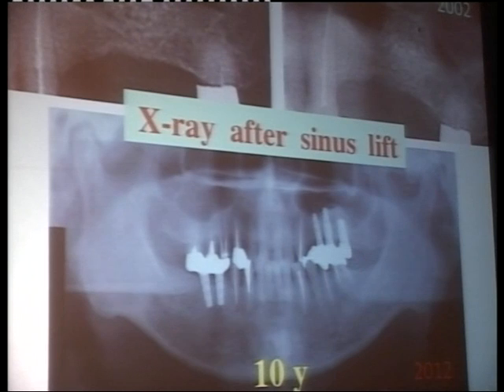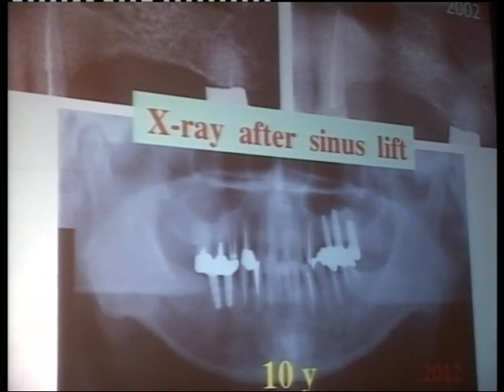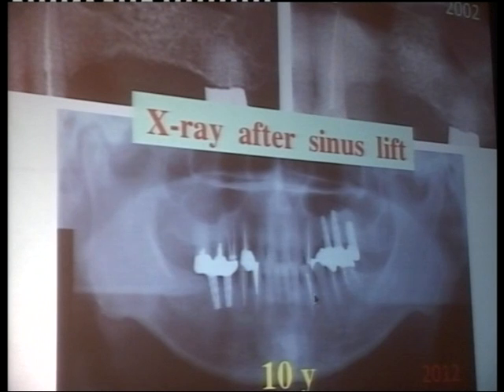2 months later, a very good dome shape. The lower X-ray is 10 years later, recent. The patient received DDM autograft for implant, and for more than 10 years, no trouble. The patient is very happy. When I implanted the fixture, I took a tissue biopsy.